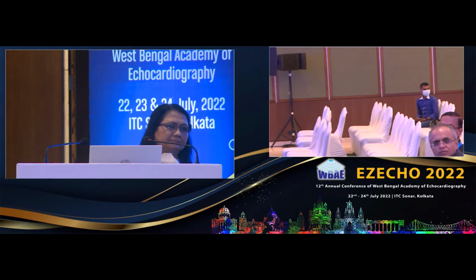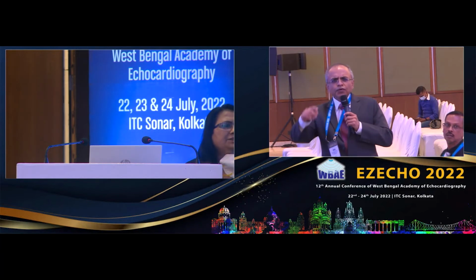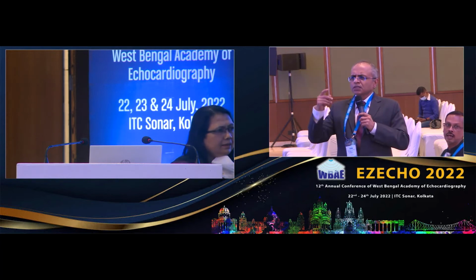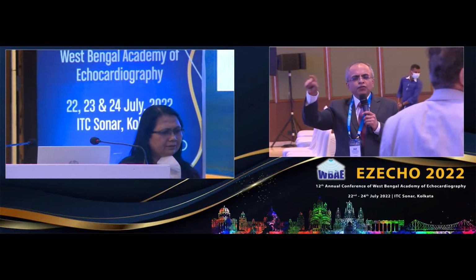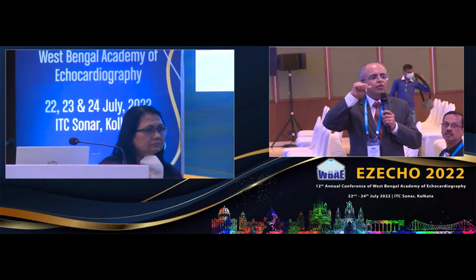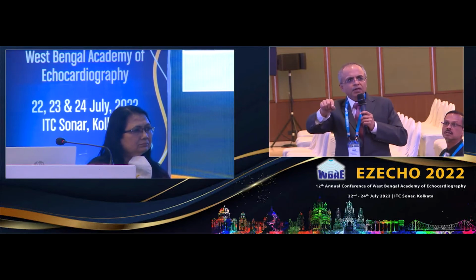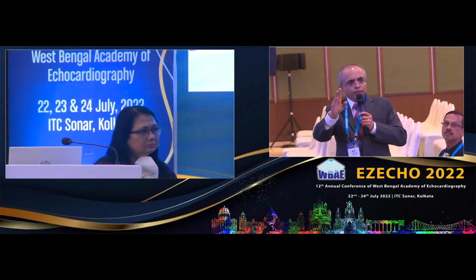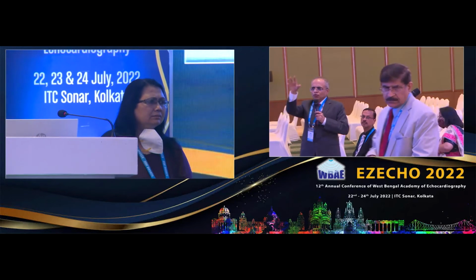Our machine has it, because trigger is there in almost all the machines. E9 has it. If you go to the physio, ECG trigger, and then there is one ECG trigger. It may be on the second screen also. Just search in the physio part of it.